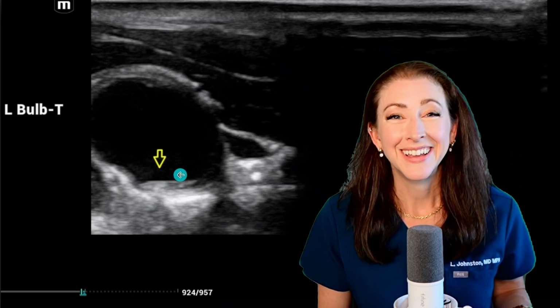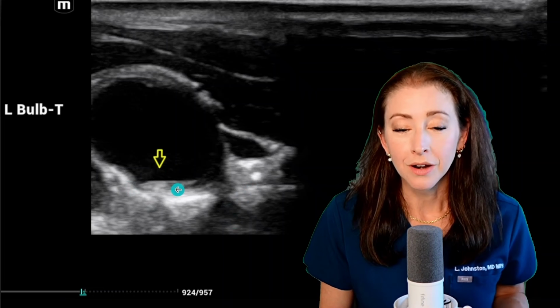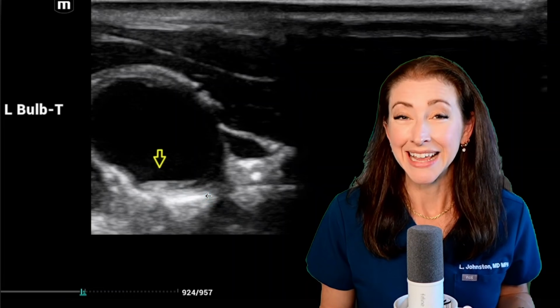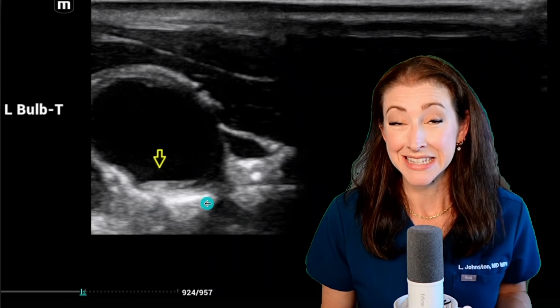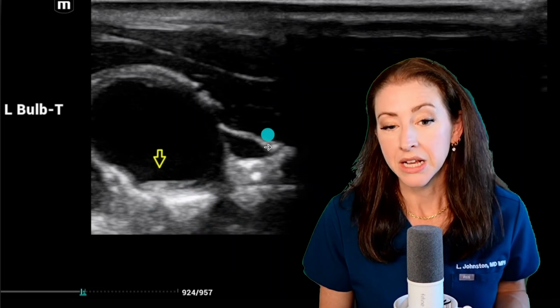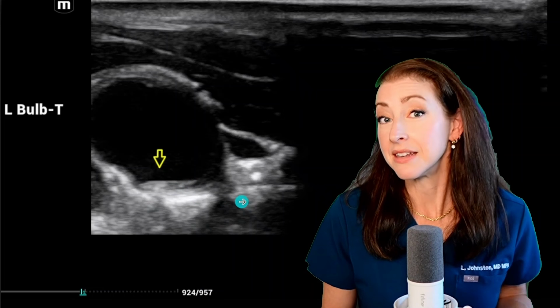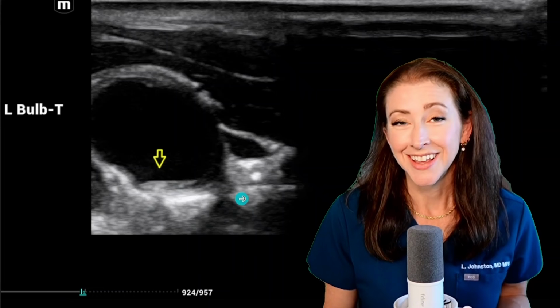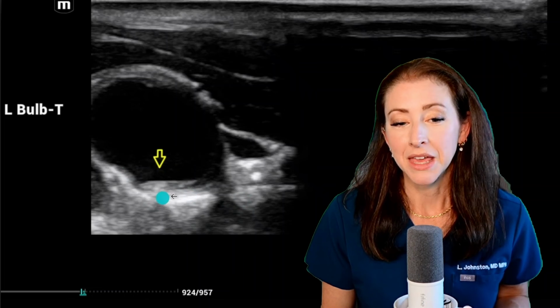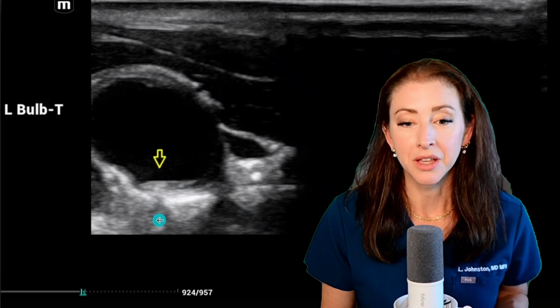We don't know. Again, there's nothing calcified here. People have asked me, what about a calcium score? I'm under 45 years old. For a woman, that's not very high yield. If my calcium score is 0, that is not very reassuring to me. And I, given this picture, would expect that it probably is, but that doesn't mean that now isn't the time to be making some different choices or changes in my own health to see if I can prevent this from accelerating or accumulating anymore.